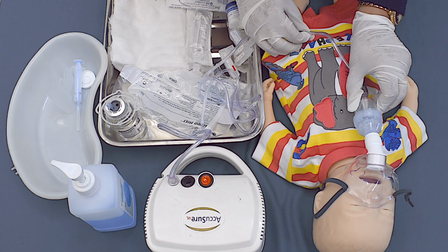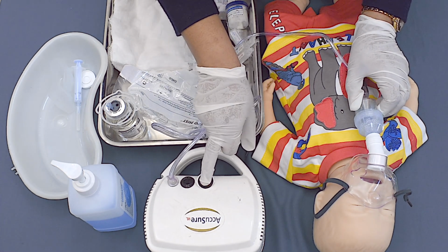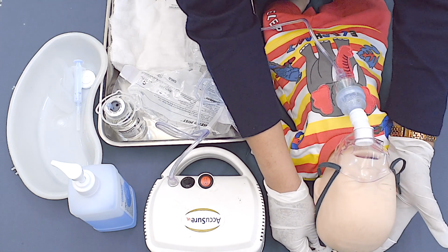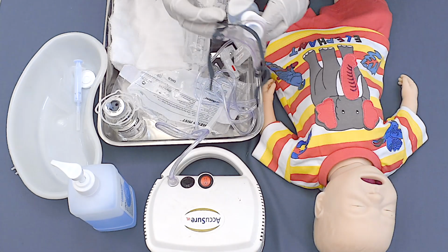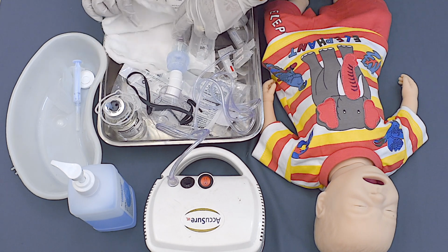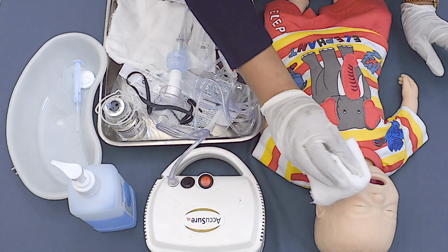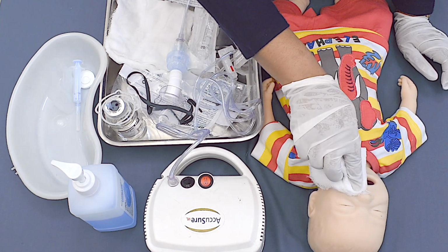After the medication is finished and the fumes stop coming, turn off the machine and remove the mask from the face. Position the baby comfortably and give a face towel or a dressing pad to the child to wipe off his face. Wipe off the face of the baby.